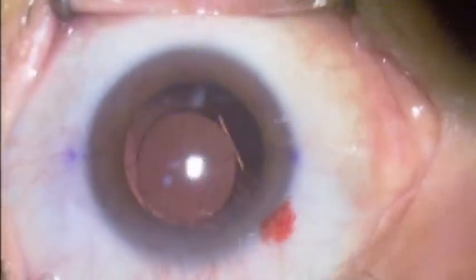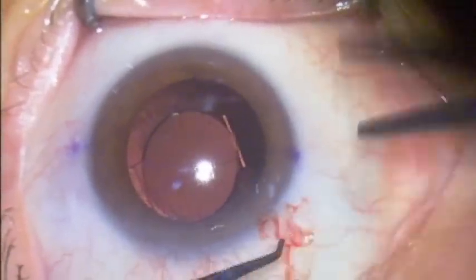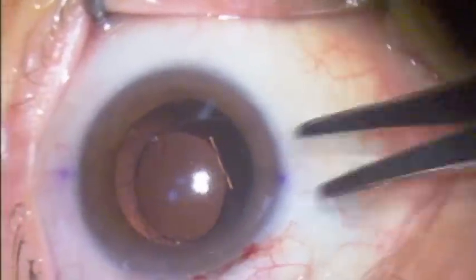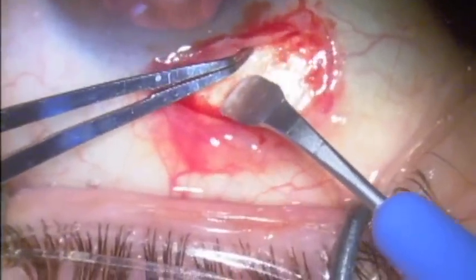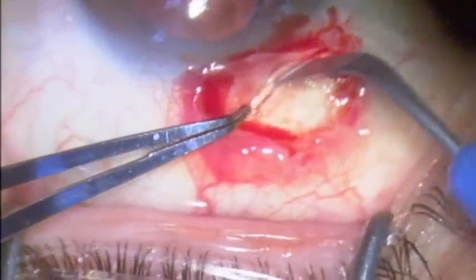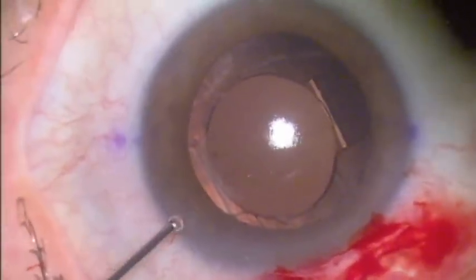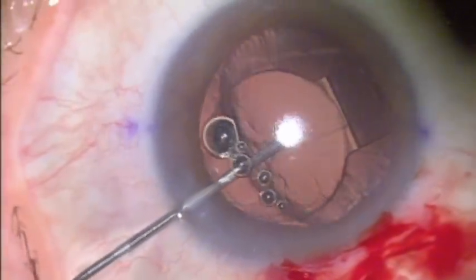This is a crystal lens exchange. The patient presented about five weeks after her initial cataract surgery with the sudden onset of Z syndrome. The nasal haptic was severely elevated and the patient had loss of vision. The original operating surgeon observed her with medication for two weeks and then referred her to me for surgical management.